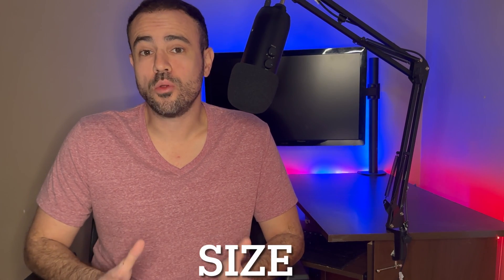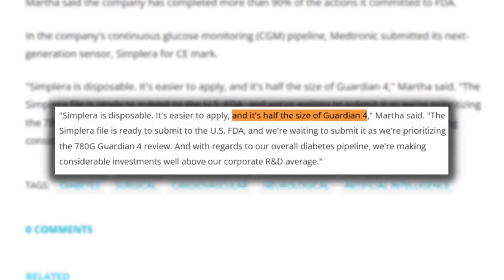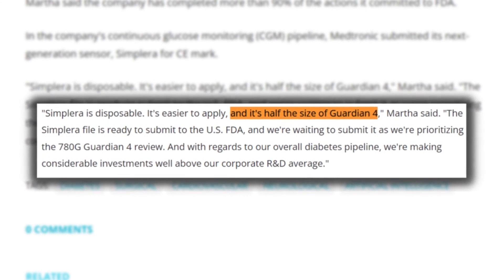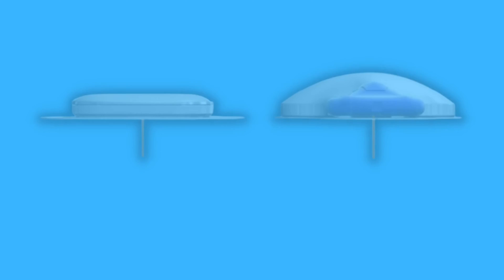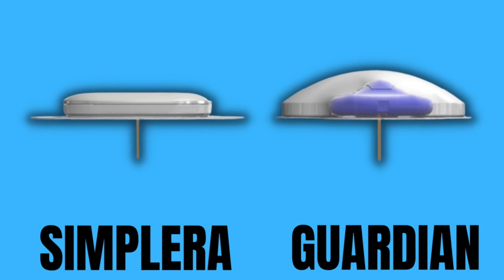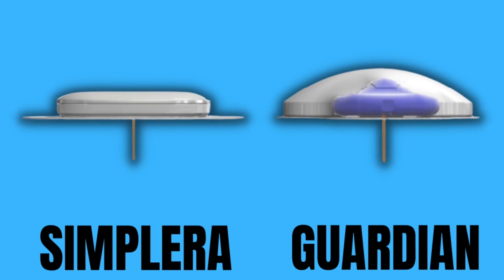Next, let's talk about size. Because they're no longer using a bulky transmitter, they've been able to shrink it down quite a bit. The sensor is reported to be half the size of its predecessor, the Guardian 4. If we look at a side-by-side comparison of the new Simplera compared to the older Medtronic Guardian, you can see just how much smaller and thinner the sensor is going to be.